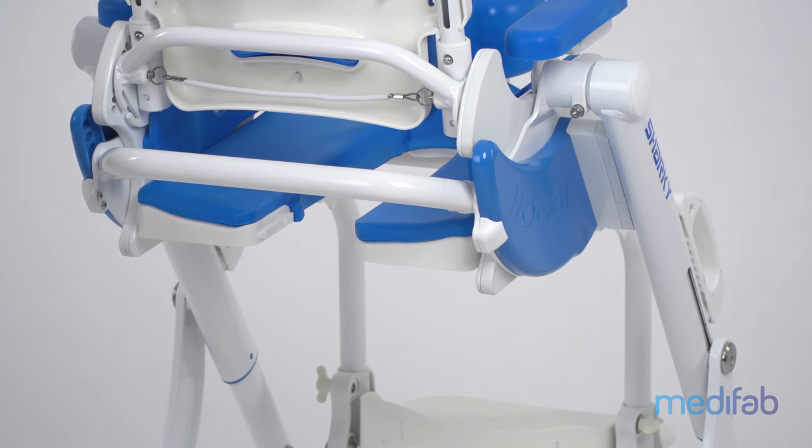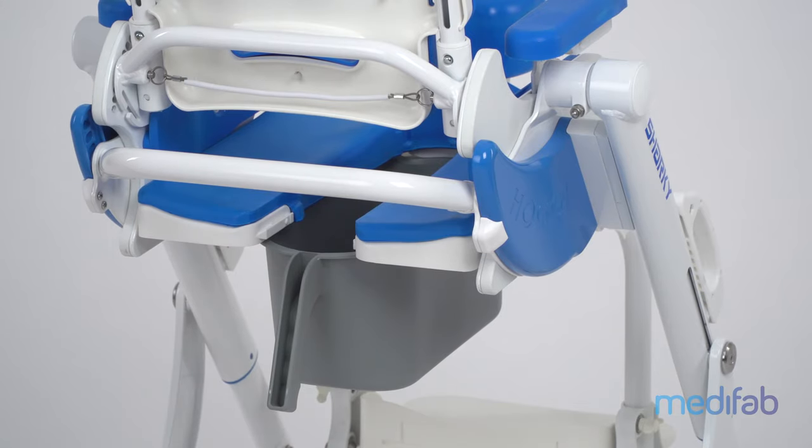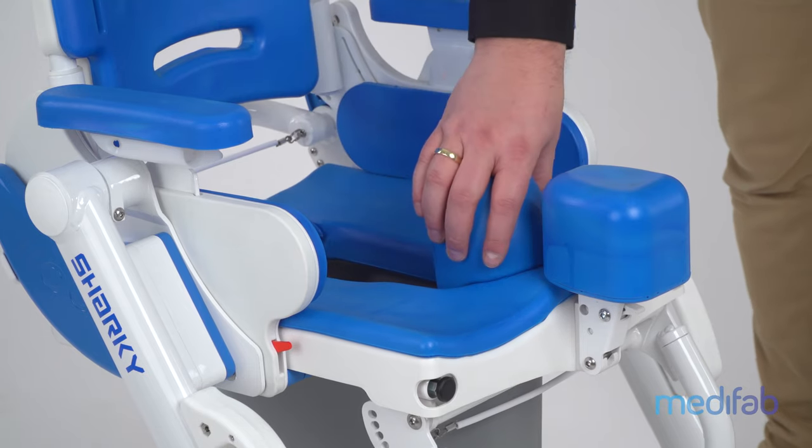Tapered rails on the bottom ensure optimum hold of the toilet bucket, even when tilted. Finally, the splash guard can be easily inserted in the seat.